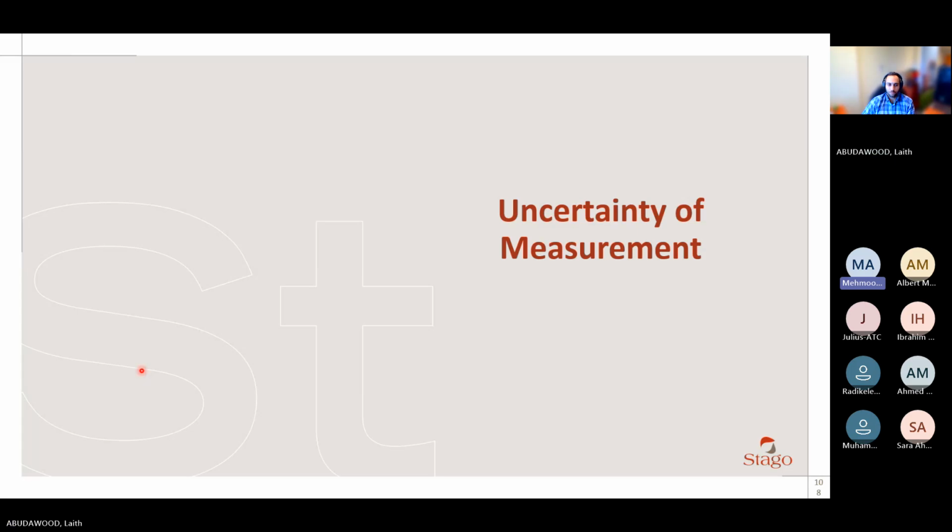As we found out in most of our troubleshootings, it was the particular timing. Sometimes they were using old controls and their controls were not passing, and sometimes they were giving some extra time after reconstitution before they load the reagents. So yes, thank you so much, Light. You're welcome. Believe me, we learned this the hard way.